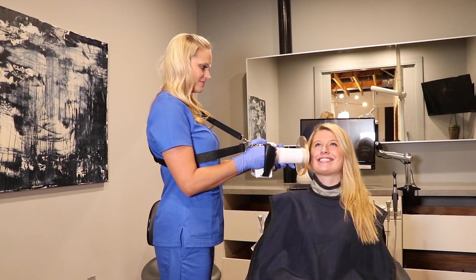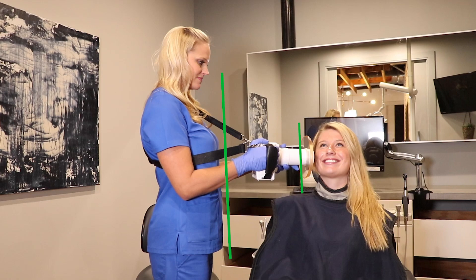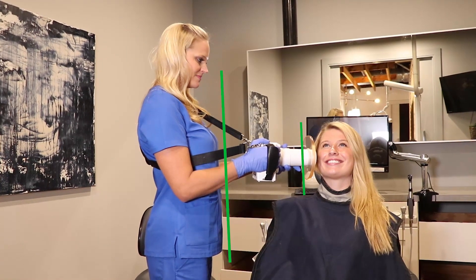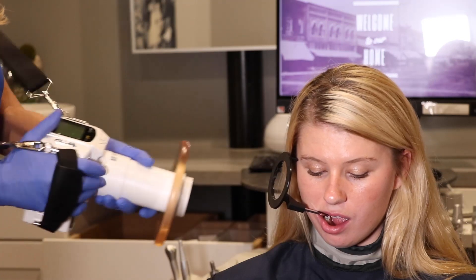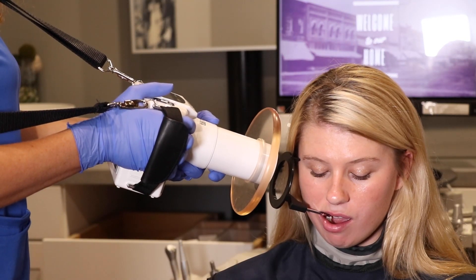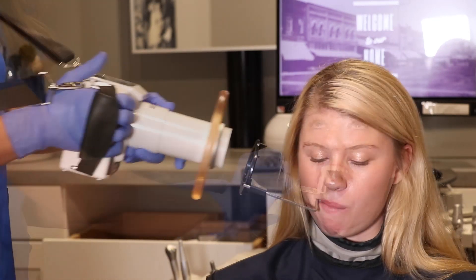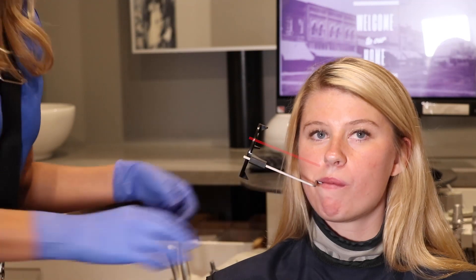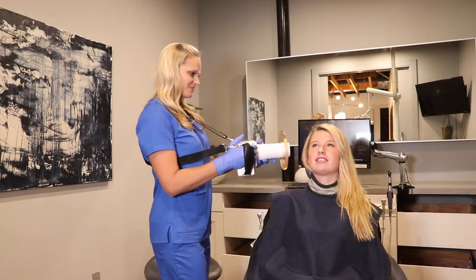Positioning. With every exposure, make sure the backscatter shield is parallel to the operator. You can use REN holders or bite tabs. If using a REN holder, we recommend the short REN bar. You want to be as close to the patient's cheek as possible with any image you're taking. The traditional REN bars can be too long, causing the exposure to remain further away from the patient, resulting in poor image quality.